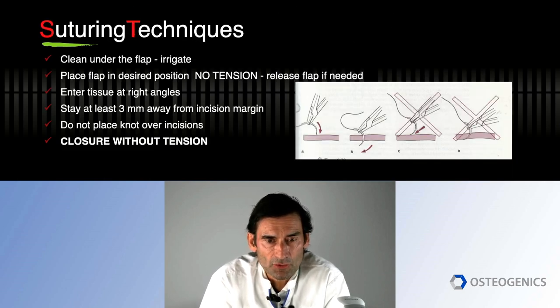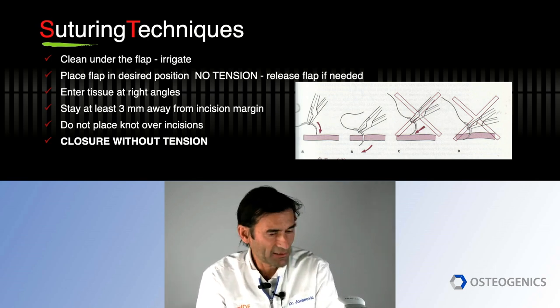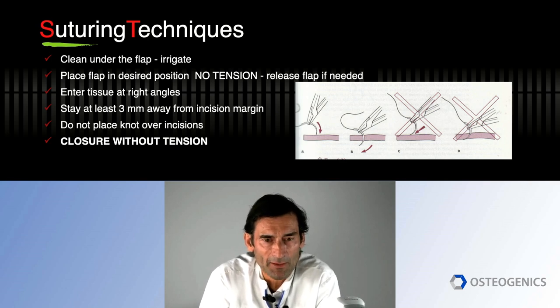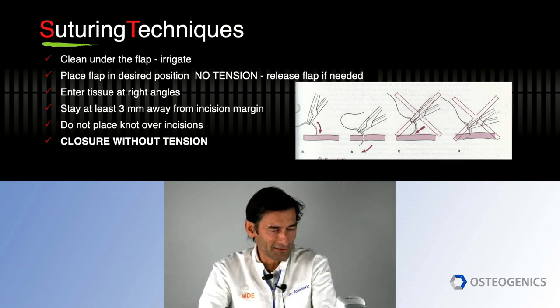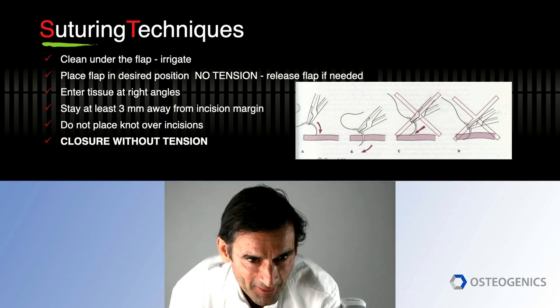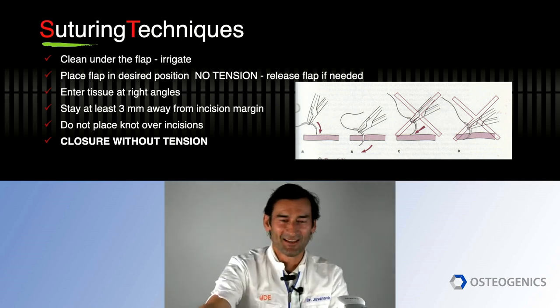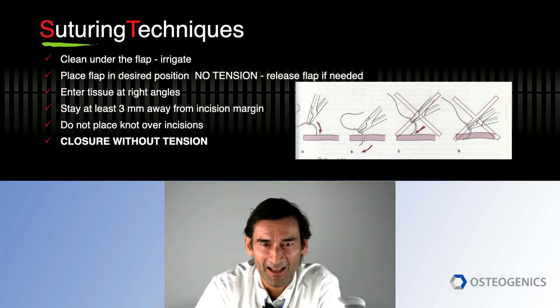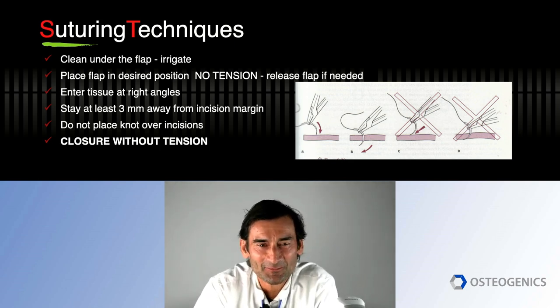Now, some parts of suturing technique are really useful. There are things you have to remember to do for sutures. You have to always make sure that when you have a flap, before you're suturing, the flap content has maximum vascularity.